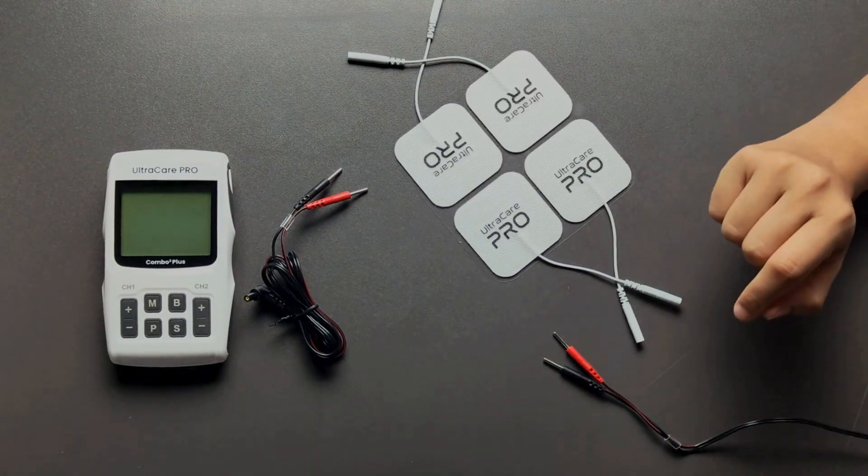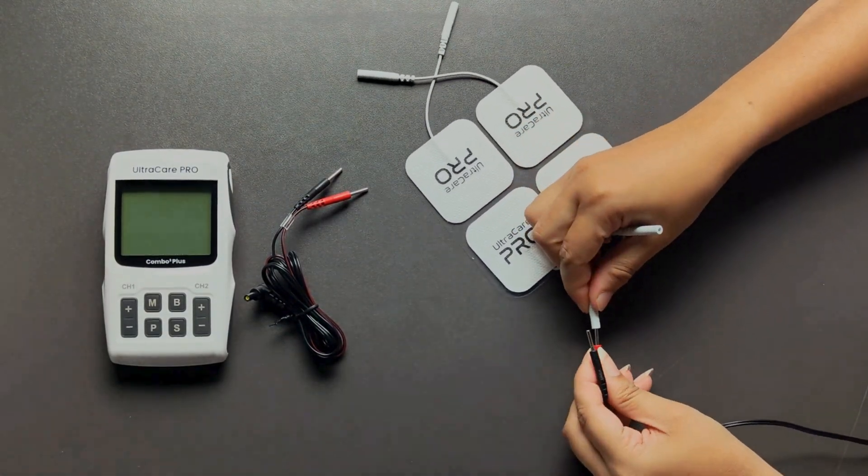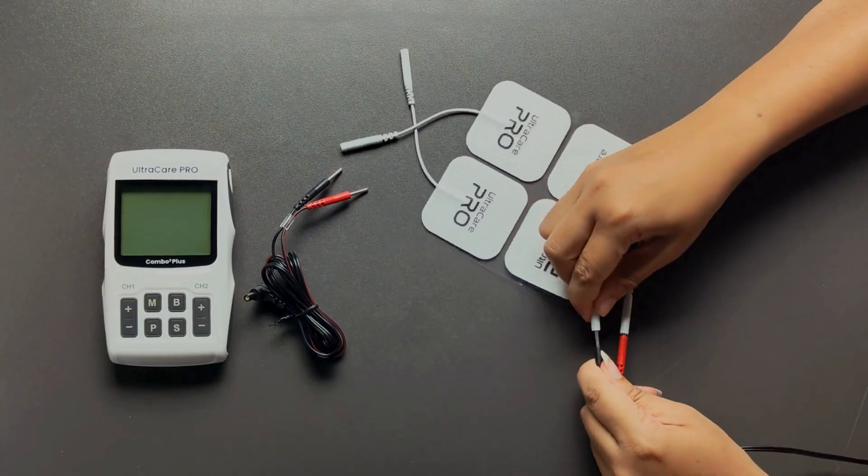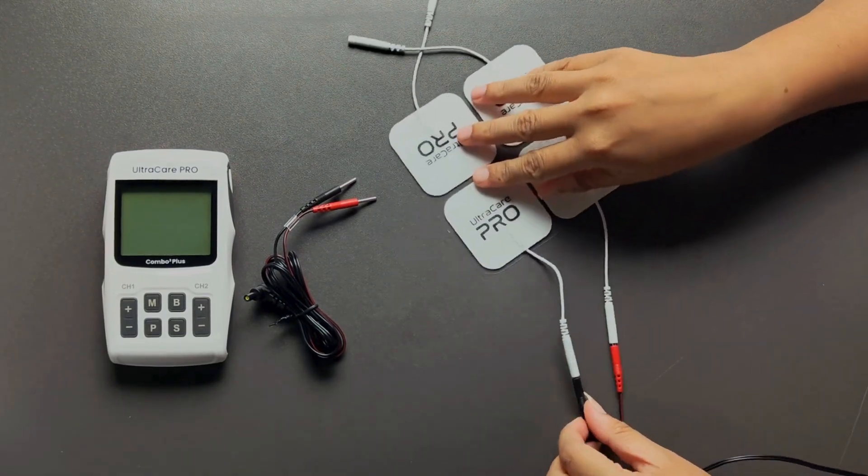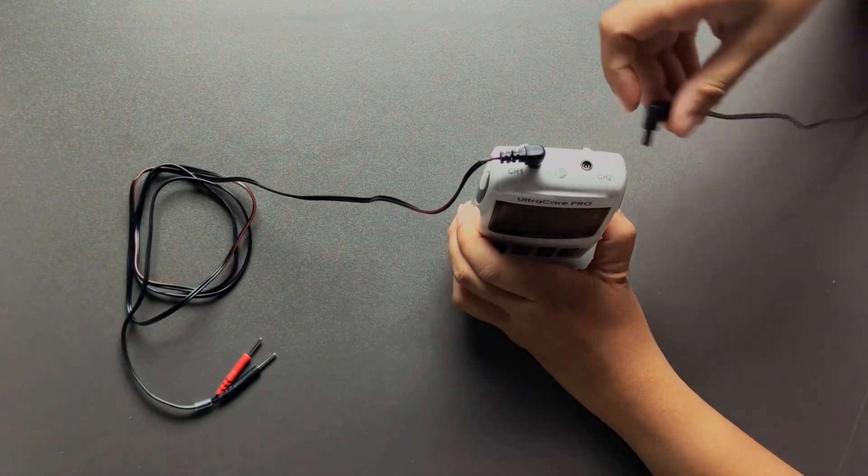First, connect the pads and lead wires. Insert the lead wires into the electrodes. Now plug the lead wires into the combo unit.